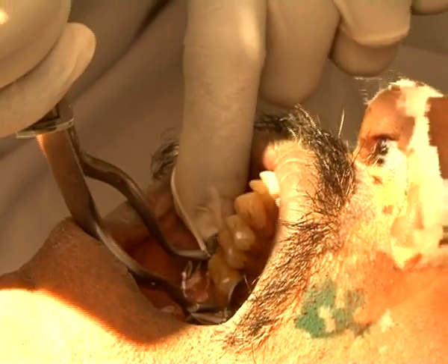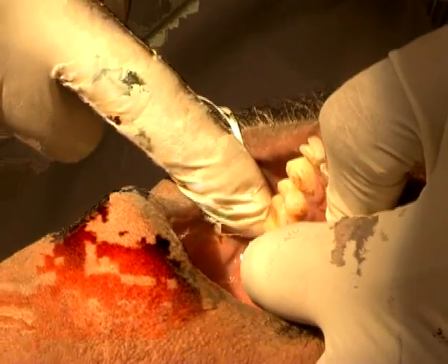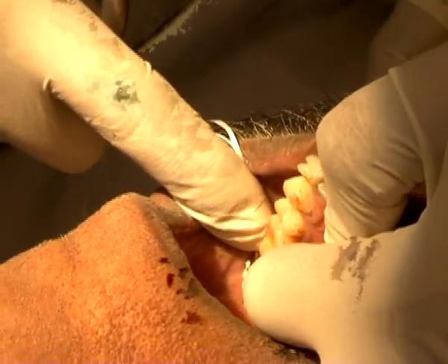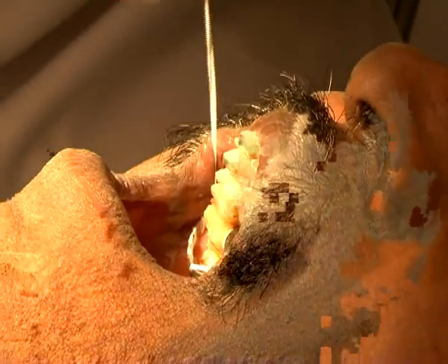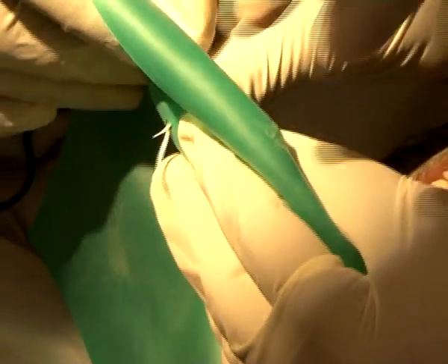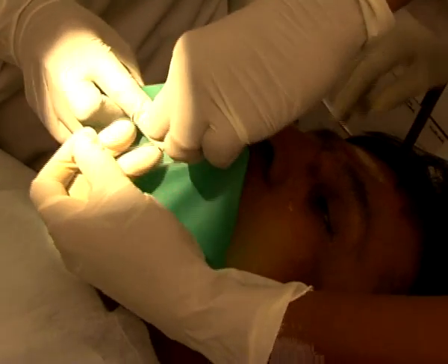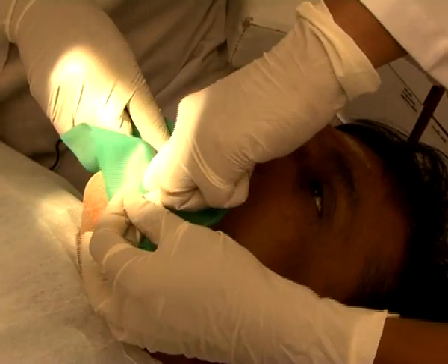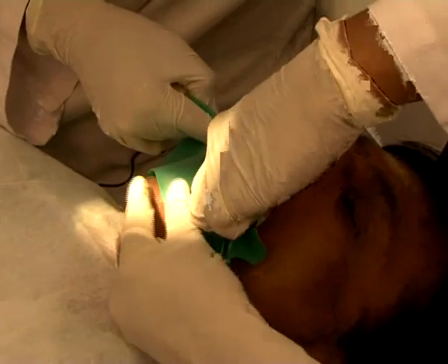Now we are going to place the clamp on the molar. It is a little bit tight. We make sure that the clamp is well secured and has all four points of contact. We have the floss here for reasons of safety. We are going to slide the floss and take this out — just take a nice deep breath.